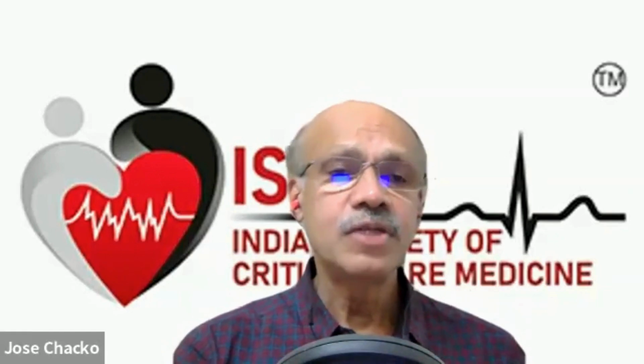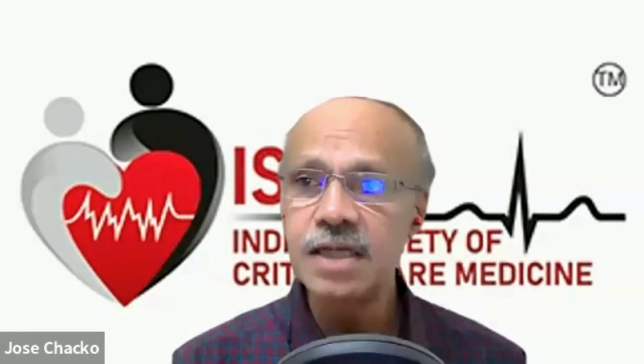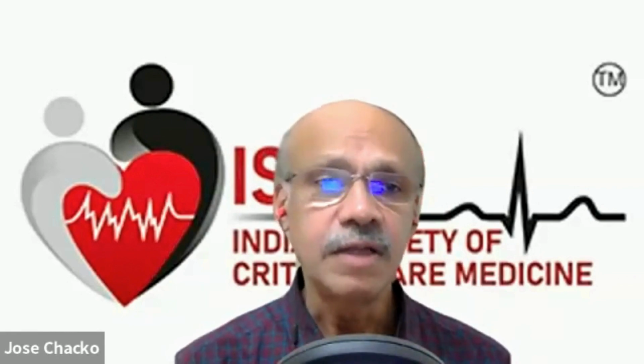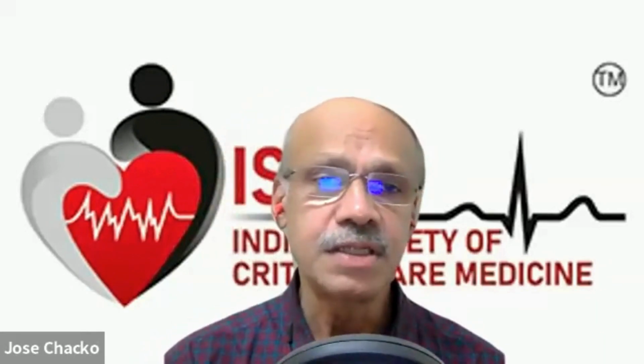The next most important thing that you would look for in a patient with shock is, does my patient have a significant pericardial effusion or pericardial tamponade? Very easy to visualize. Basic echocardiographic skills is all you need to look at the collection of fluid around the pericardium, and features of tamponade may be obvious, as in right-sided collapse in diastole. Both the right atrium and the right ventricle may collapse down in diastole, and that is a sure indicator that your patient is at high risk of tamponade or already in tamponade.